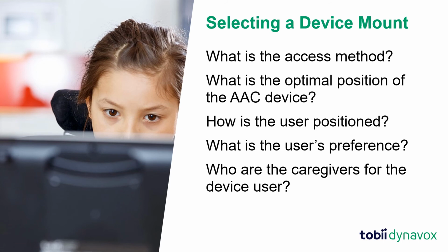Who are the primary aides or caregivers for the device user? Knowing this information guides the support and training needs. We must consider who needs to learn how to use the device mount. Also, can they easily adjust, lift, or assemble the device mount?